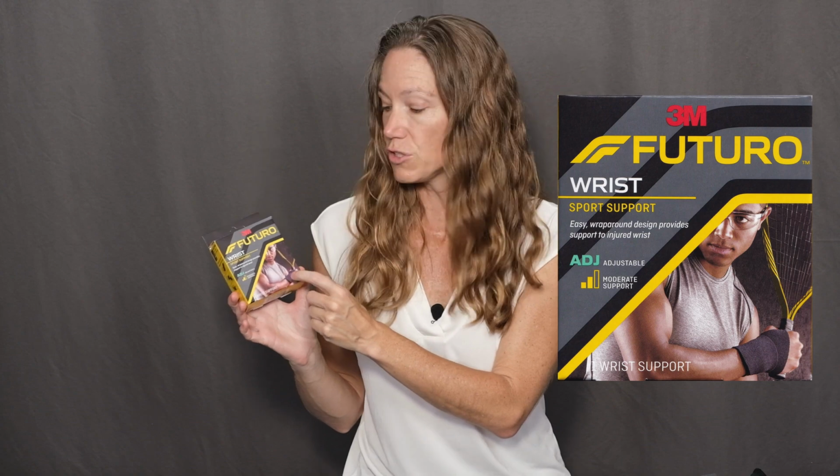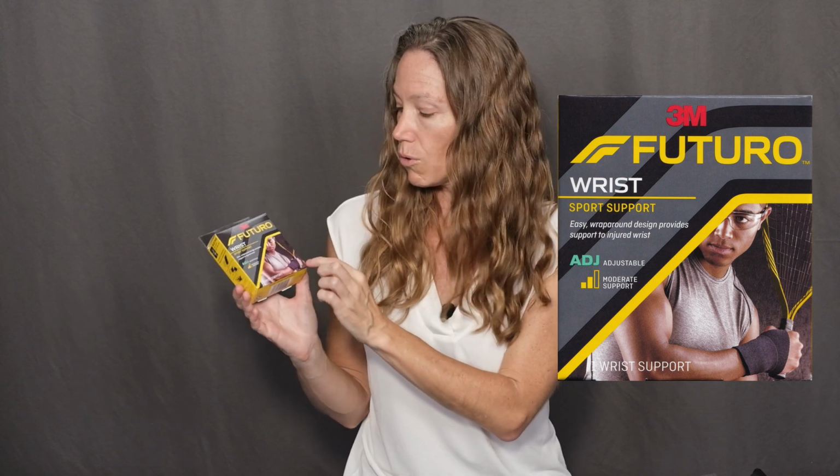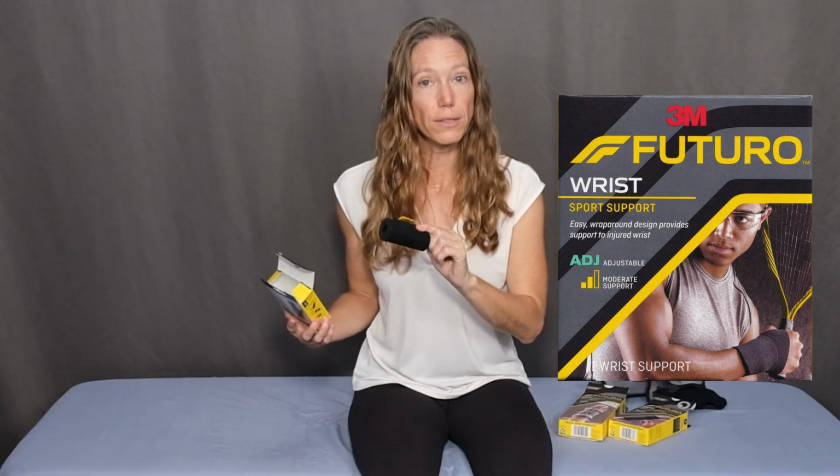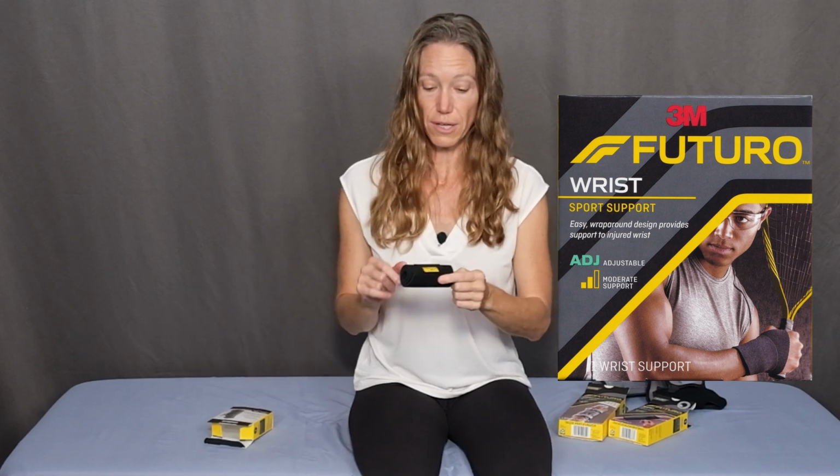Now this is also labeled as a moderate amount of support, but you'll see when I open this up, the profile of this brace is much lighter and it doesn't have a metal stay. So I would be able to hold more tools. I could hold, for example, this person in the picture is holding a tennis racket. So I could do more activities using this brace than I could the last one I showed you. This one is also not labeled left or right. So that means it can be switched from side to side.